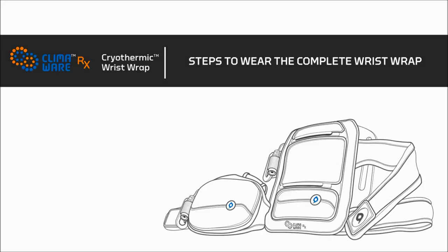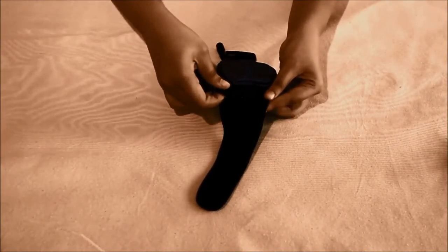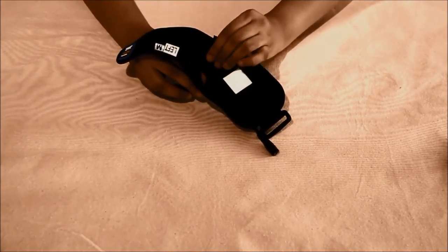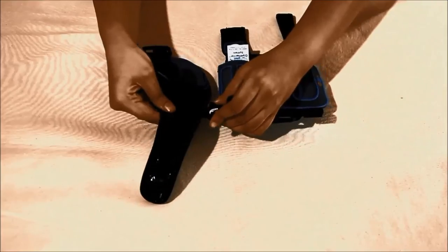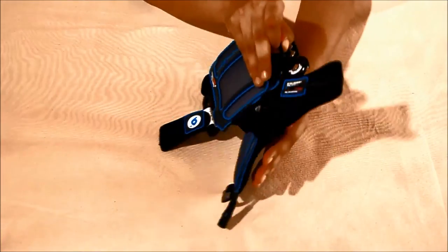Let us go through the sequence of steps to wear the complete wrist wrap. Begin by inserting the detachable thumb spica into the designated thumb slot on the thenar eminence wrap and fixing it with the velcro underneath. Next, insert the velcro hook on the contoured hinge leg into the velcro pocket on the thenar eminence wrap and secure in place.